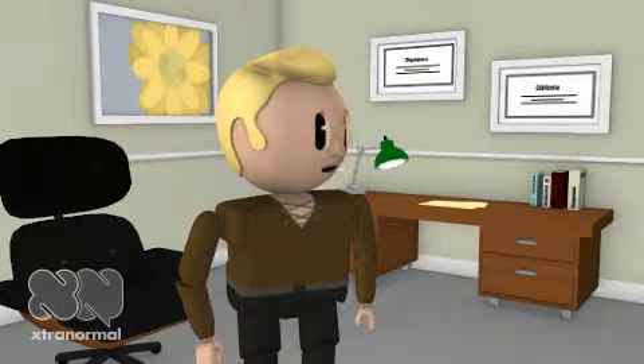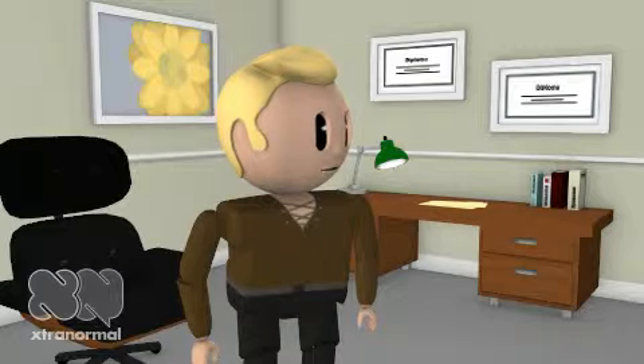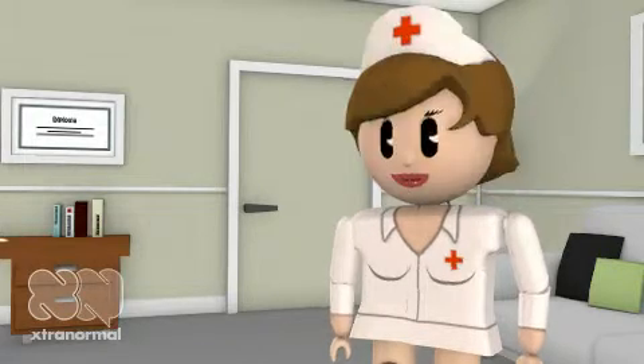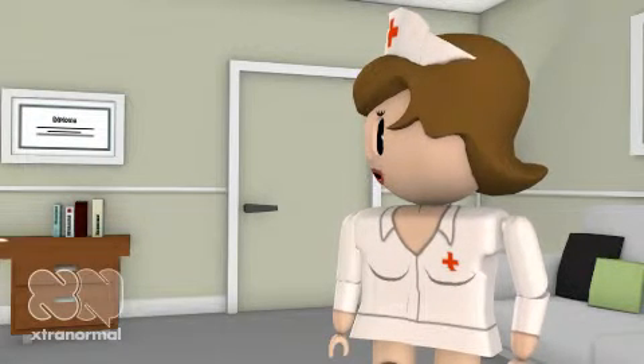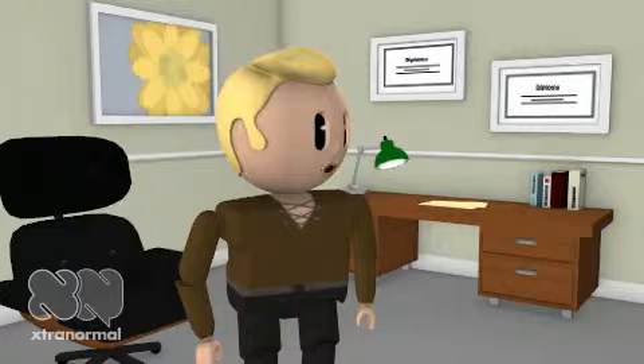Hello, I'm Adrian from the vascular team. I was called to come up and go through nursing care of sequential compression sleeves. Oh, thanks Adrian. It was me who rang you, I'm Ruth. I have a patient who has to have sequential compression sleeves and I'm not very familiar with them at all. No problem, let me show you how they work.